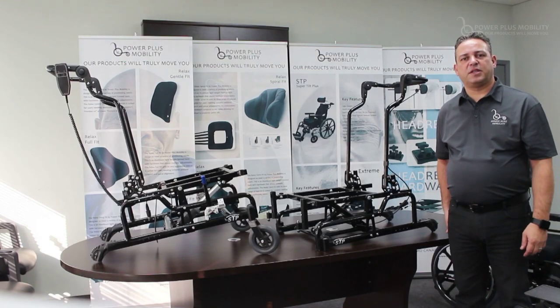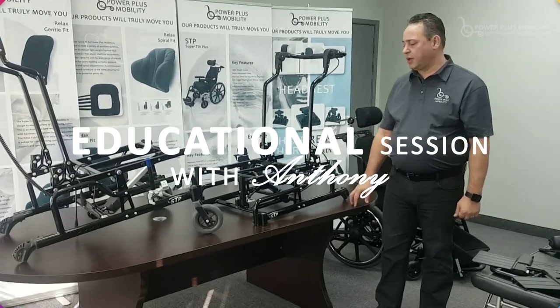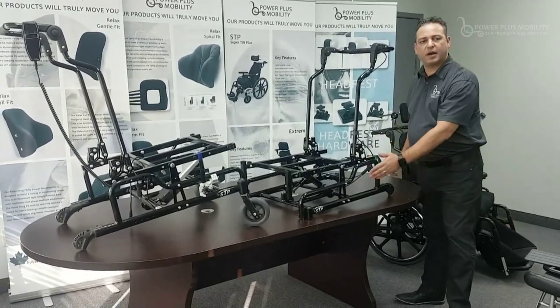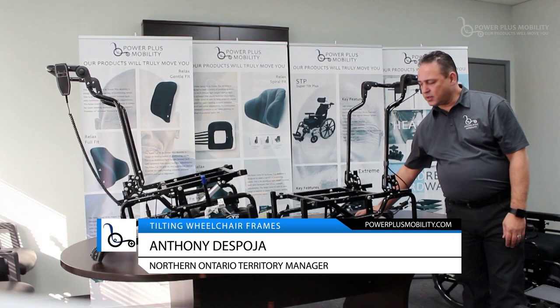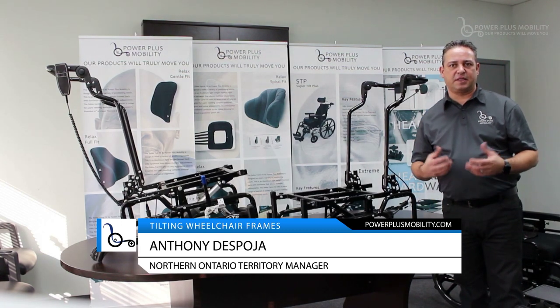Welcome to Power Plus Mobility's educational session on wheelchairs. The first thing I'd like to talk about is how our lower frame assembly is assembled. We have two side frames — a left frame and a right side frame — and they are mounted by two oval bars. By having two oval bars versus a circular bar, it rigidizes the frame and keeps it nice and sound.